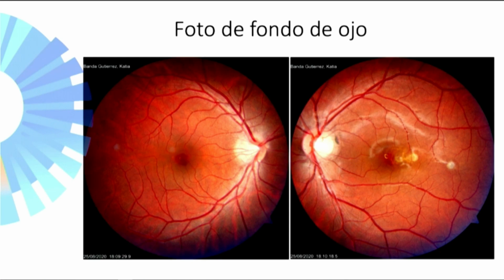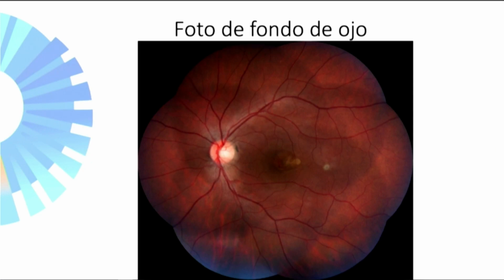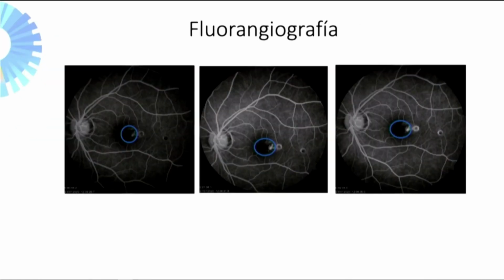But on her left eye, we see peripapillary atrophy, and on the posterior pole, we see whitish, yellowish subretinal lesions with some distance between them, and we can see some pigment changes and detachment of the pigmented epithelium on the retina. On the remaining equator and behind it, no alterations. We just saw it on the posterior pole.